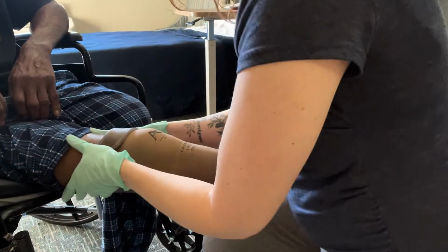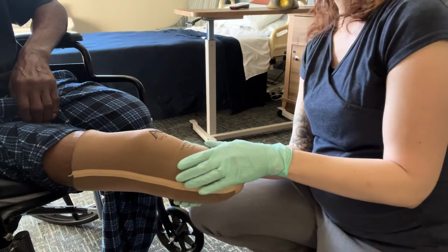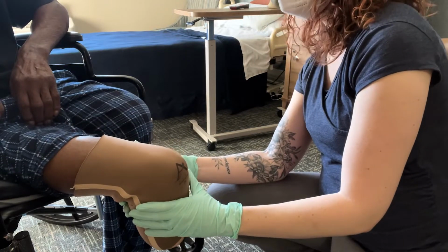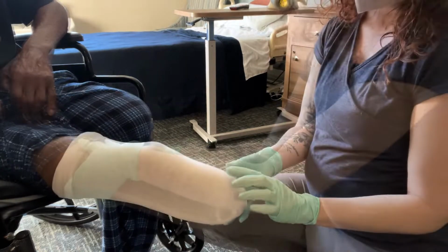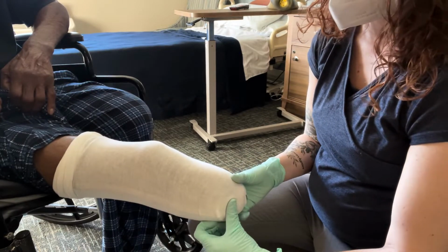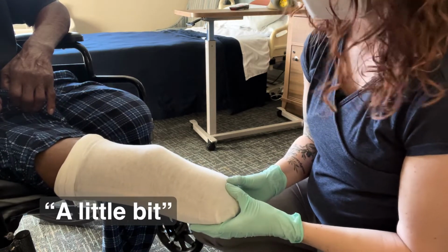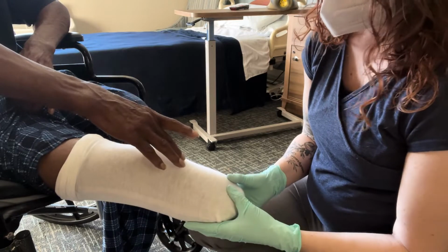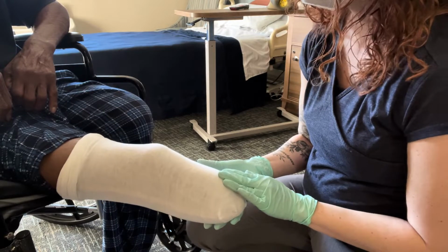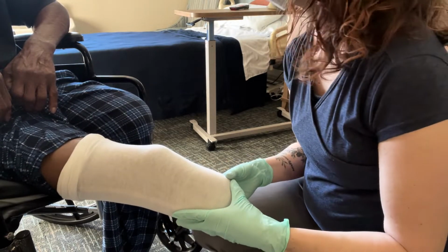It's probably going to feel snugger because that other one is pretty worn. How does that feel though? Feels good. Alright, go ahead and bend your knee for me. And that feels okay? Alright, and relax. I know last time we talked about how this bone's a little bit longer. Do you ever get pain and pressure on this outside here? A little bit. But mainly here? Yeah, mainly up here. Any pressure up here too, or just in this area? Just this. Most of that's just that the socket is big.